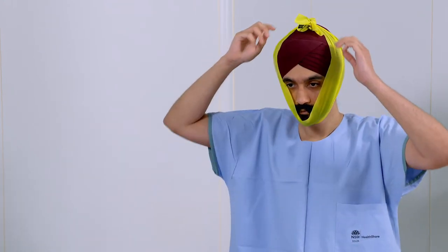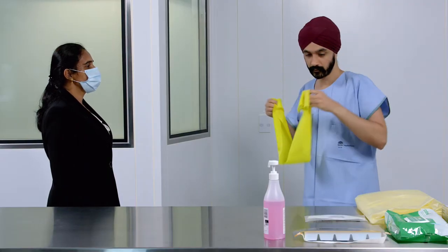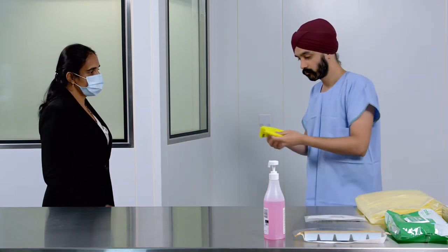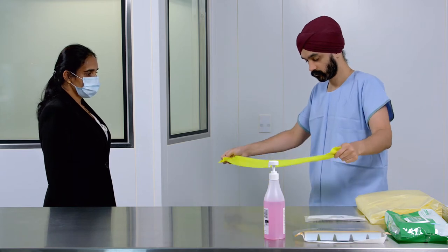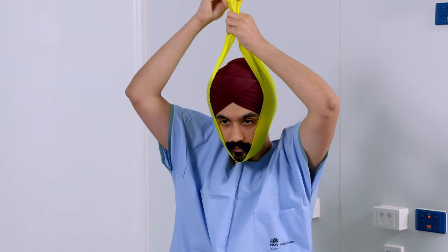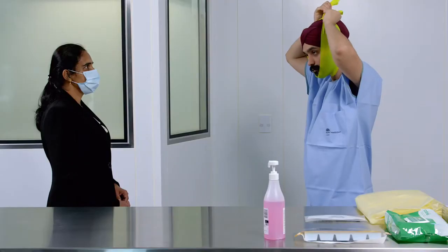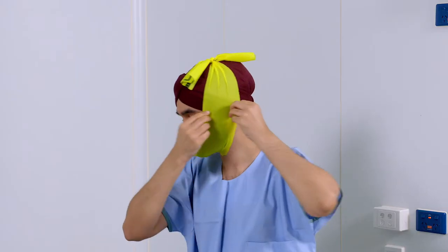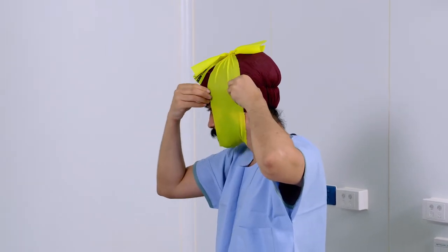If folds are present, you'll need to select a band with a narrower width. If wrinkles are present, then stretch out the band from the top to remove all wrinkles.